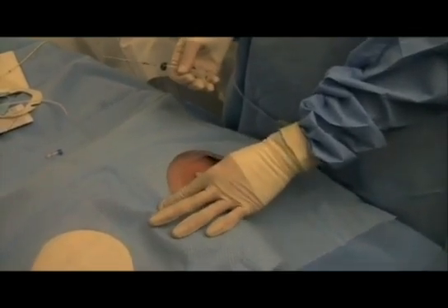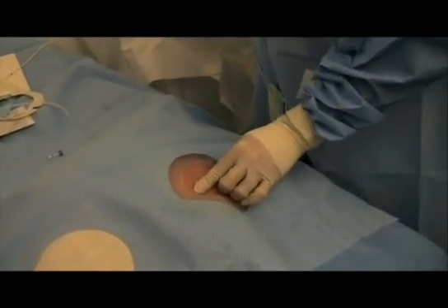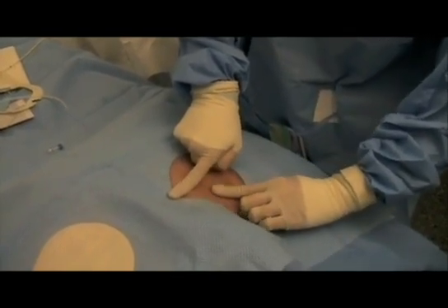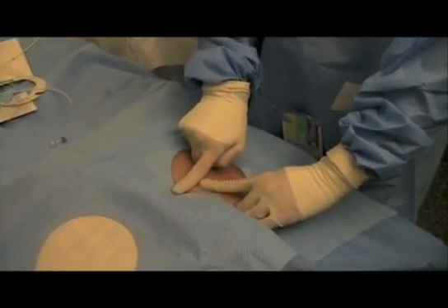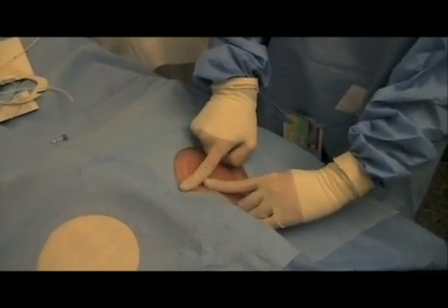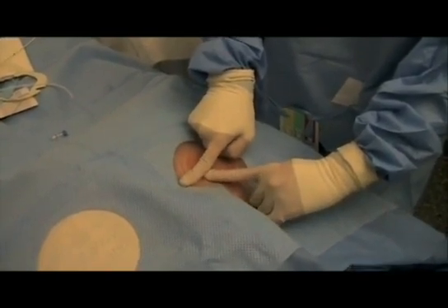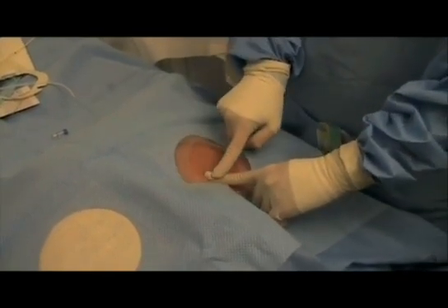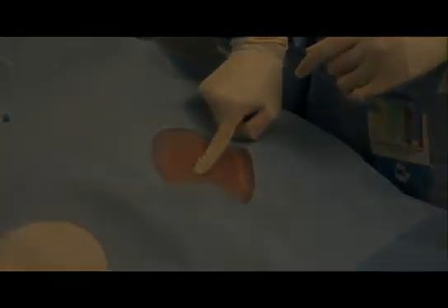You want to feel the sternal notch and you want to actually find your clavicle, and that's what I'm feeling now. At some point, the clavicle actually changes from a straight to a kind of swept-back diagonal portion. You can see this finger is representing the portion coming from the sternal notch straight out, and then it transitions to an actual slant back towards the patient's shoulder. Where that straight portion meets that angled portion is where I'll actually go underneath the clavicle.